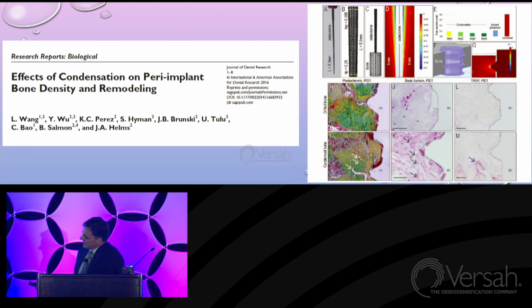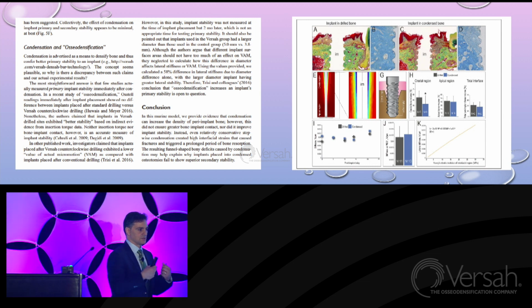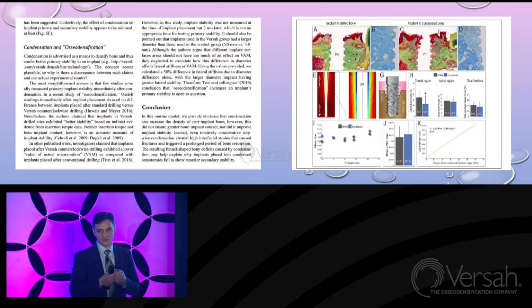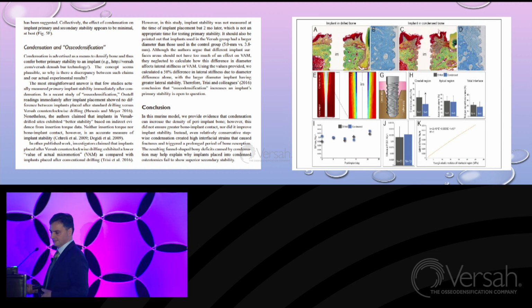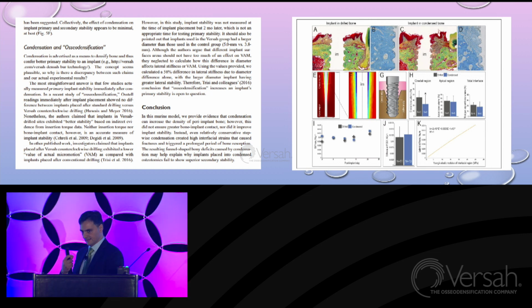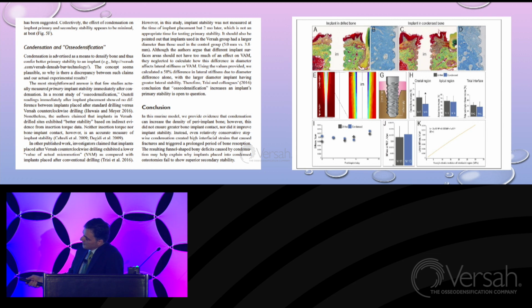Unfortunately, they almost mention osseodensification as condensation, which is not exactly the same, as you will see, as you have seen in the morning. And they concluded that the condensation is not good for the bone. But we already knew this from many papers. It cannot be confused with osseodensification. It's a totally different process.